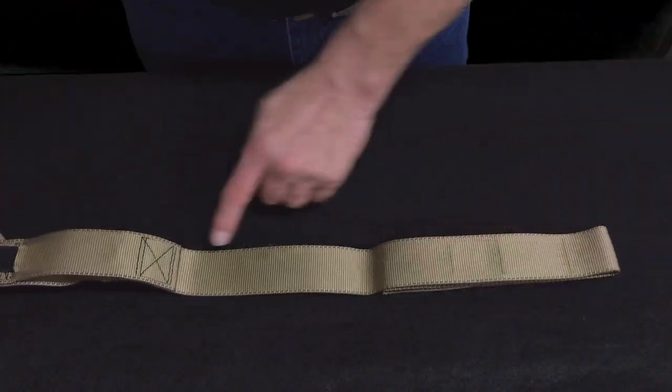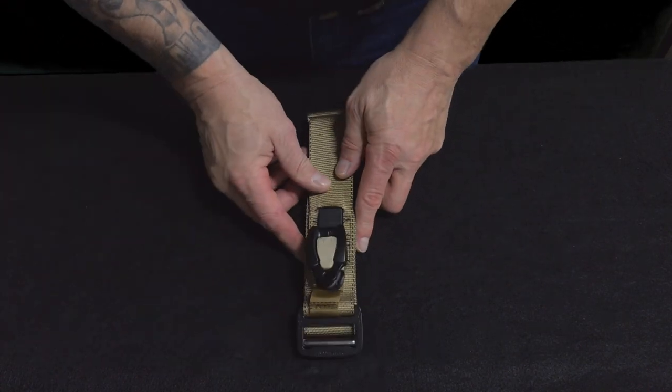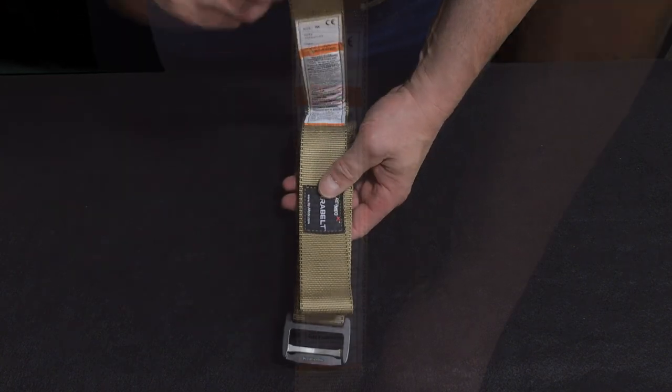Parabelt is made in the USA. We use mil-spec 1.75 inch webbing and a one-piece Cobra frame buckle that are both rated at 4,000 pounds. A space is provided on the label attached to the webbing to record the time the tourniquet was applied.